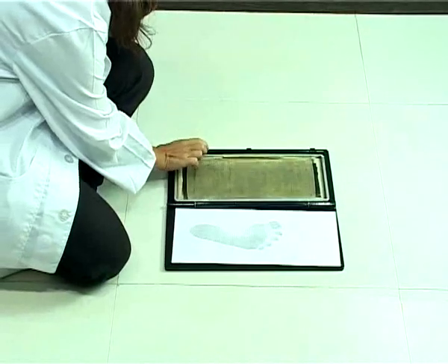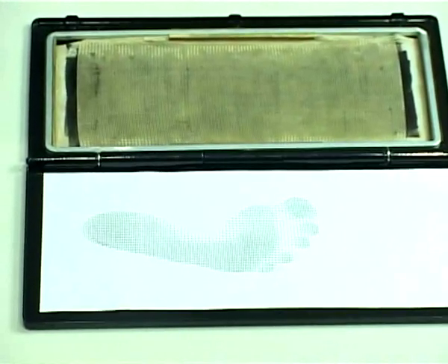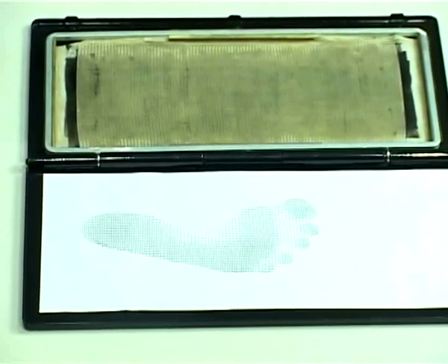Ask the patient to walk or step over the mat. Depending upon the walking style and the pressure exerted, the ink on the mat gets transferred to the paper to get the imprint of the foot.